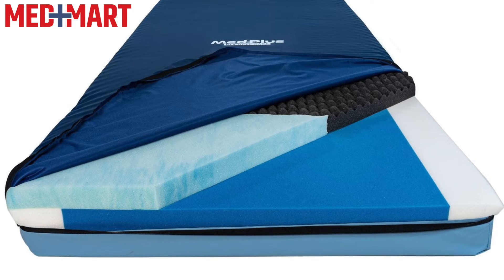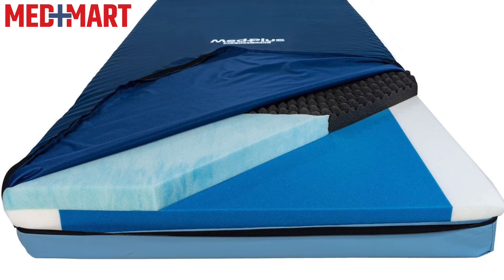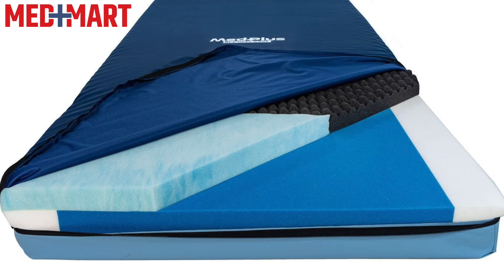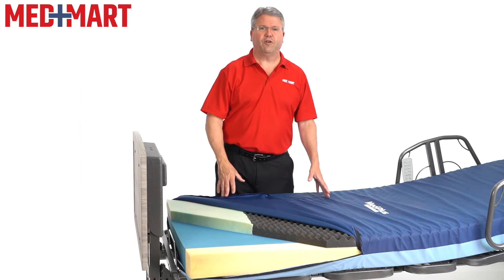The HeelCare RLX mattress has a dual-layer foam design. The under layer will not bottom out, so if you're sitting up in bed, it's there to provide support. It also has a contouring layer on top which helps give you support no matter what position you're in.